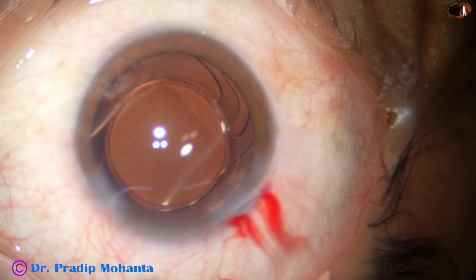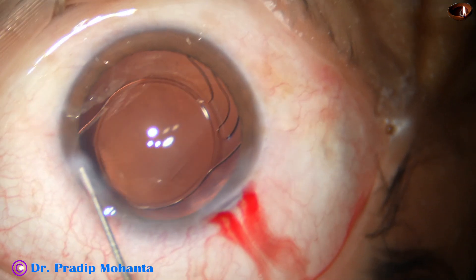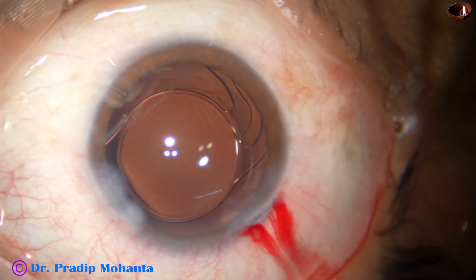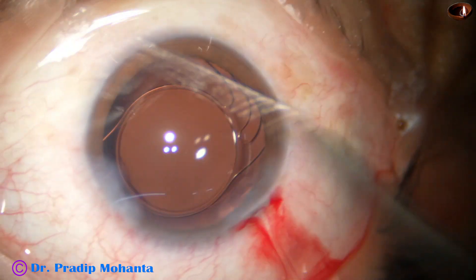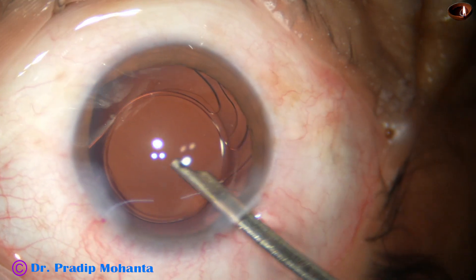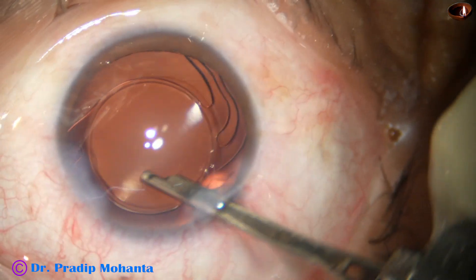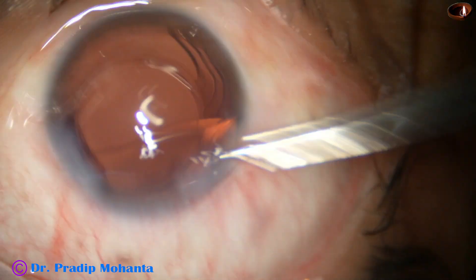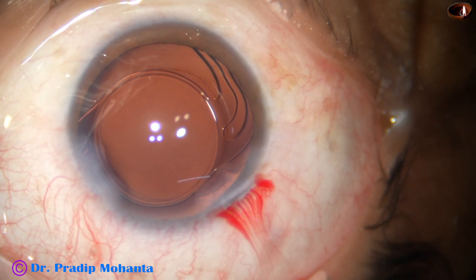This is moxifloxacin. The sideport is closed by corneal stromal hydration. If the wound is not stressed, a lot of hydration is not required. And now the anterior chamber is nicely formed and the case is concluded.